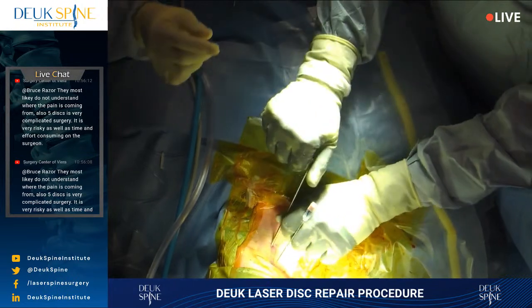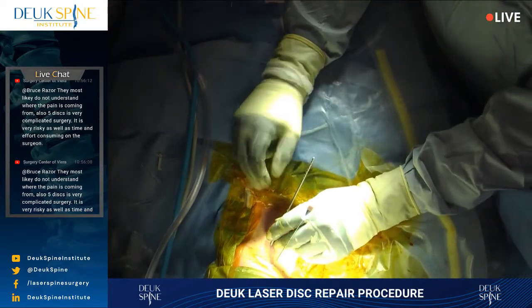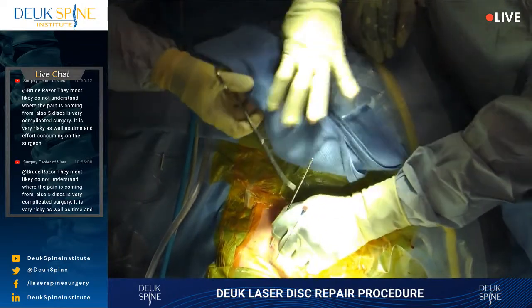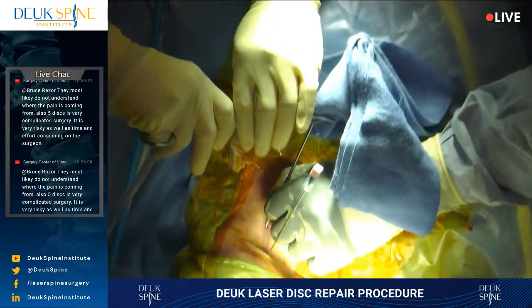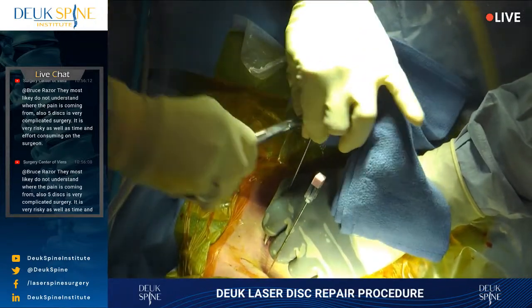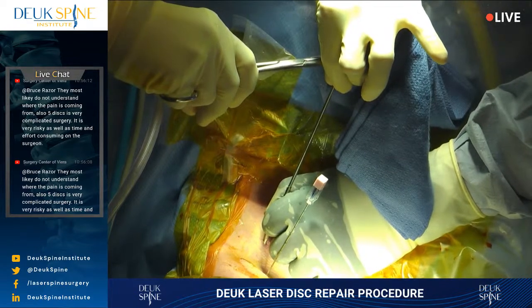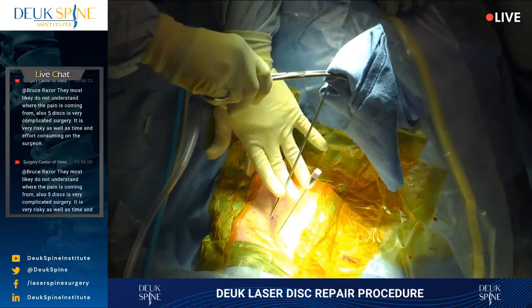You want to try to get that out? Without pulling the tube out. Let's see if you can move it. Again, we have some cold welding going on between the dilator and the tube. You get it? Yeah. Shot? Beautiful, nice job.